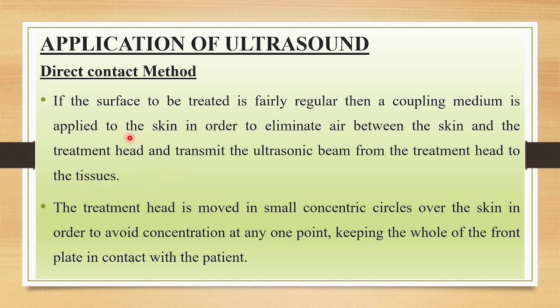So we directly apply gel to the patient's skin, and then we apply the ultrasonic head on that coupling medium. Then the air at the interface between your skin and the head will be less. The treatment head is moved in small concentric circles over the skin in order to avoid concentration at any one point, keeping the whole of the front plate in contact with the patient.